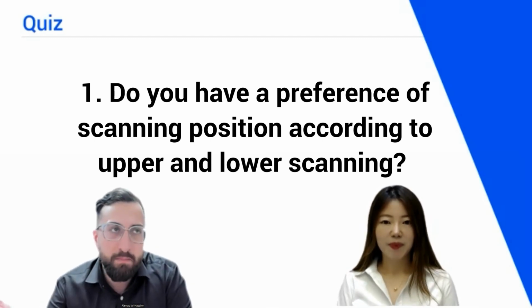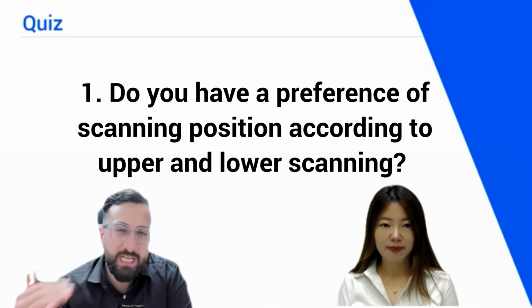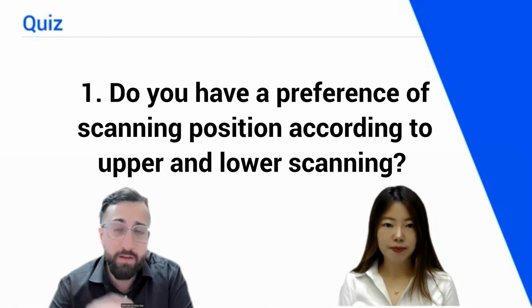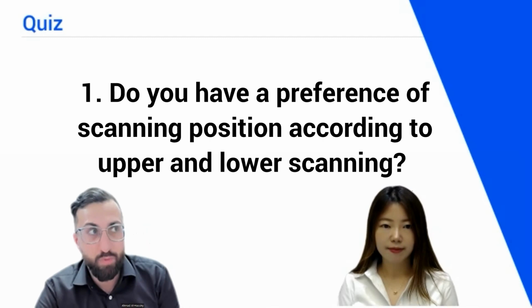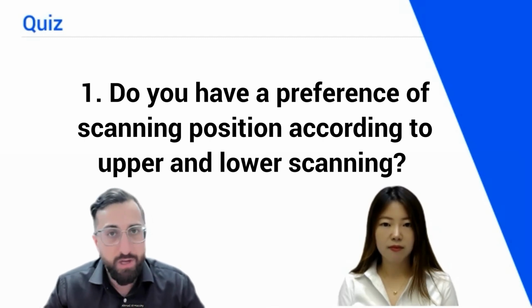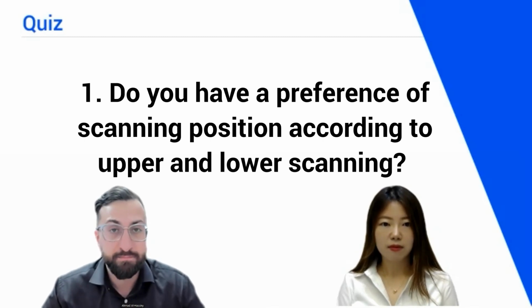So when I am scanning or doing any dentistry, really, I'm always at the 10 to 11 o'clock. 10 to 11 o'clock position is where I usually stand. When I'm scanning, I'm also at that position. Even for the lower arch, which I know some people say you can stand more like 7 o'clock in front of the patient to scan. I personally don't find that useful. I usually stick around 10 to 11 o'clock, and that's how I do all my scanning.